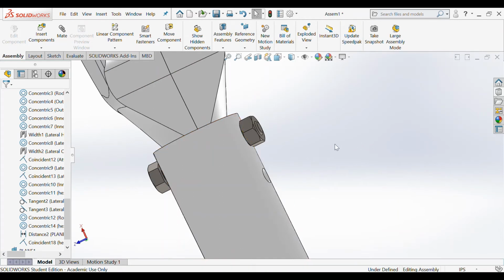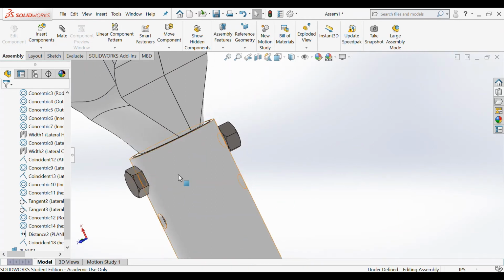So again, the reason why we made this reference plane was to mate this top surface of this bolt to the reference plane in order to give it its correct position. And we couldn't just choose the surface of the inside of this bolt to be coincident to the cylindrical surface here because it is not flat.